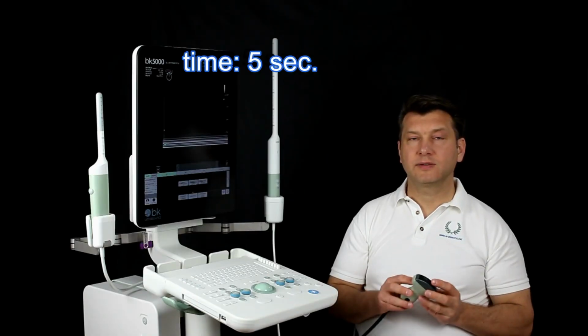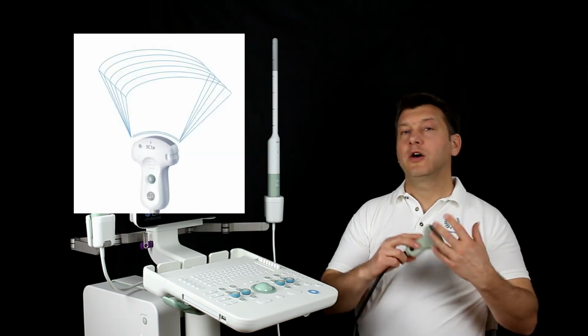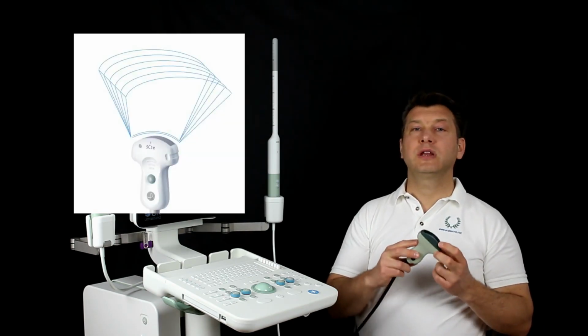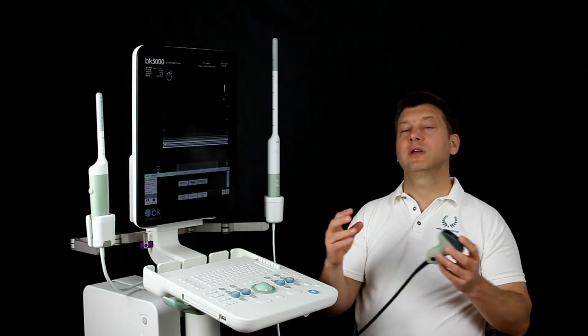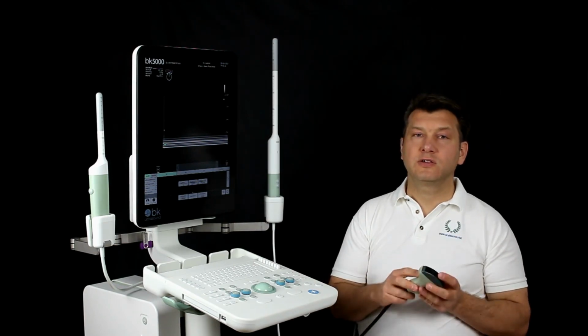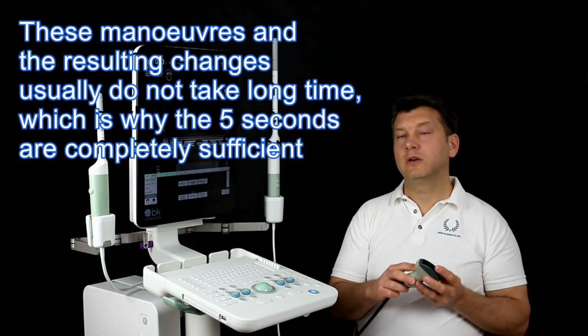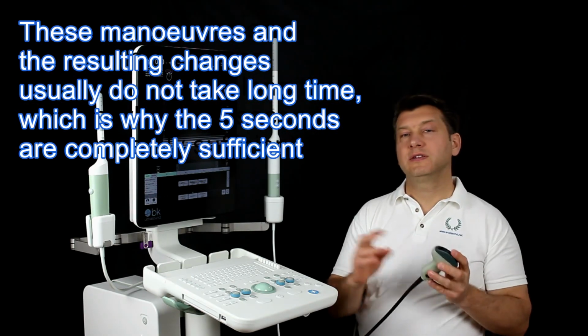Time 5 seconds. In this short time, about 100 single pictures are taken as a fan and summarized into a 3D block. This is done both at rest and during the Valsalva. These maneuvers and the resulting changes usually do not take a long time, which is why the 5 seconds are completely sufficient.